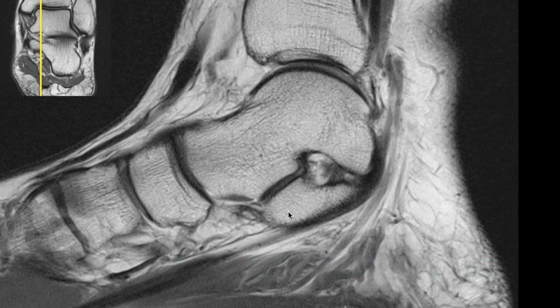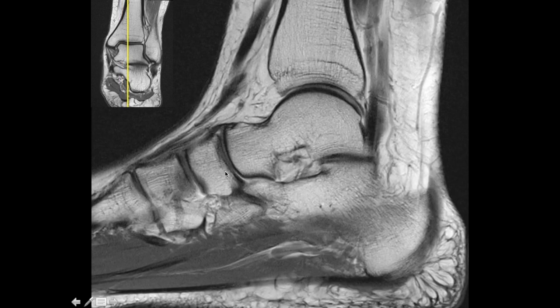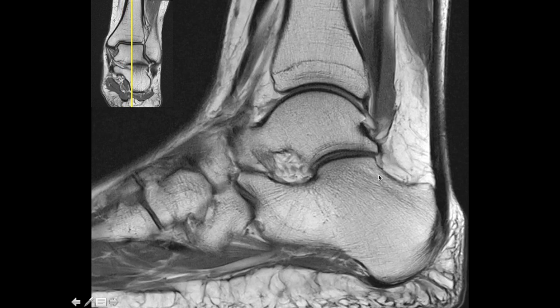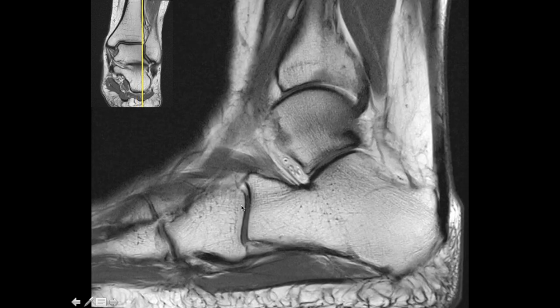Coming back medially you see another joint between the talus and calcaneum — this is the mid subtalar joint. The anterior subtalar joint is not that important. The talus consists of the talar dome and the head and neck region. The talus articulates with the navicular bone — this is the talonavicular joint. Going laterally you see the calcaneum and the anterior process of the calcaneum. Further laterally, the calcaneum articulates with the cuboid — this is the calcaneo-cuboid joint.